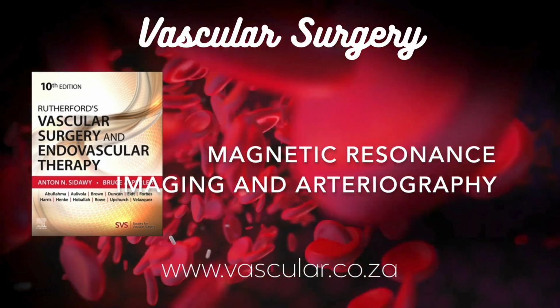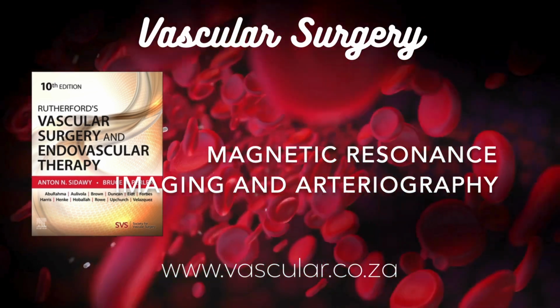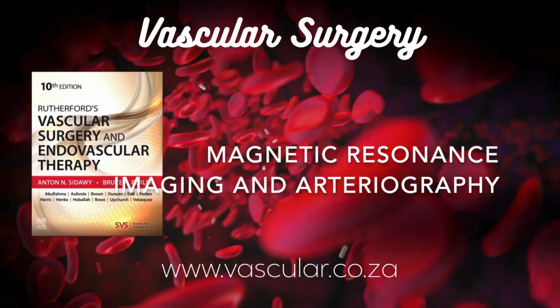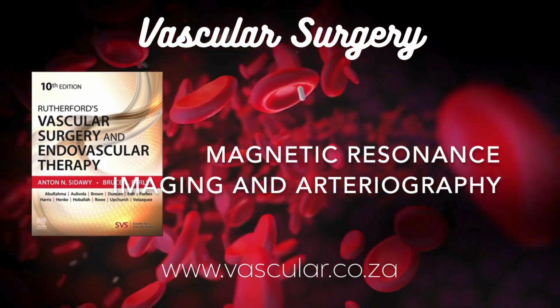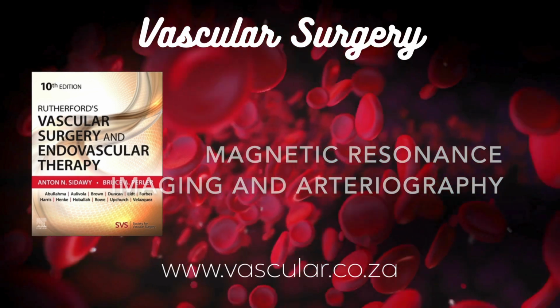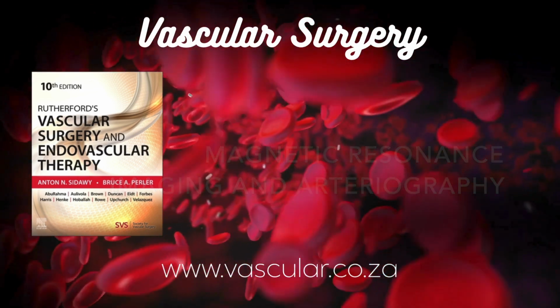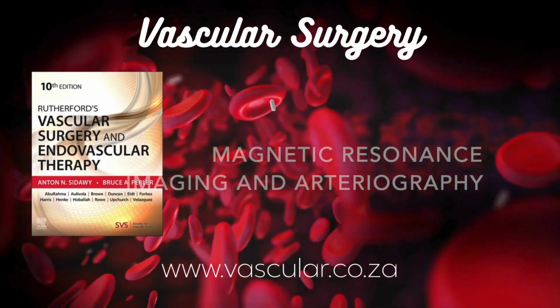Okay, looking ahead now. What exciting future advances are coming down the pike for MRA? Lots of cool stuff happening. Those continuous moving table techniques are getting smarter, better synchronization with contrast, reducing artifacts further, and then there's time-resolved MRA. What's that again? It's acquiring multiple rapid snapshots as the contrast flows through. This gives you dynamic information. You can see the direction of flow, watch arteries fill, then veins, assess how quickly things wash out. Like a movie of the contrast passage.